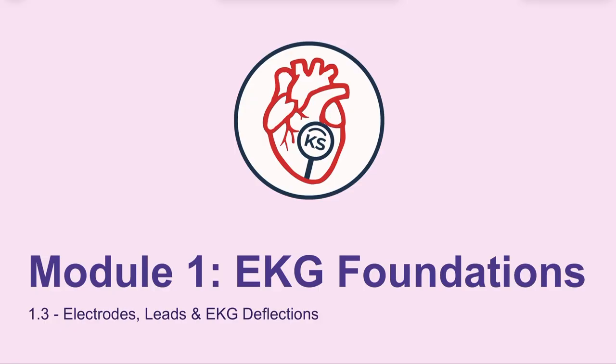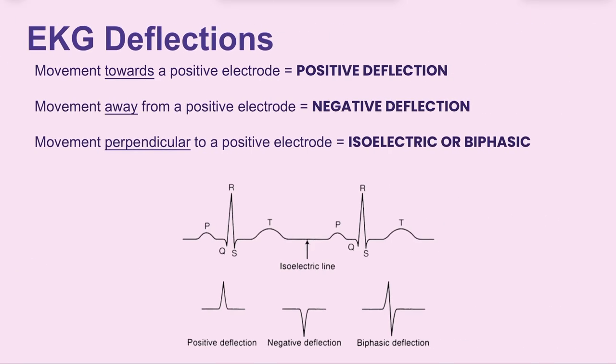All right, electrodes, leads, and EKG deflections. This is, again, foundation to the EKG. We're talking electrodes here, which moves us into a little bit of a different topic, but hopefully we'll break it down in a way that's digestible for you, okay?